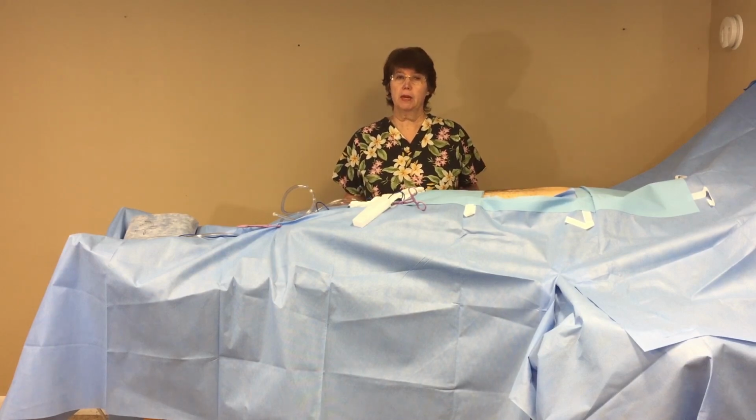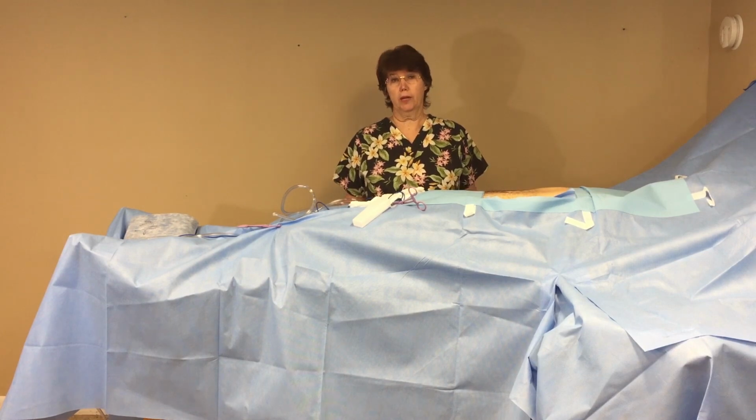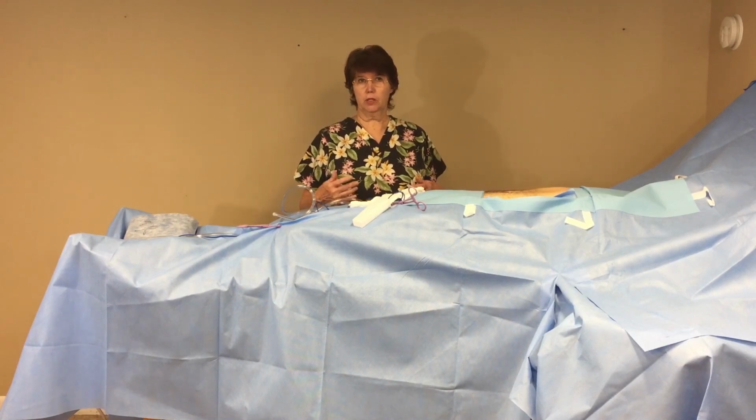Let me preface this by saying, obviously, it's always best to have a Foley in first before the procedure starts, but sometimes you get stuck, so what can you do? So I'm going to run through what I do and do whatever you feel works for you.